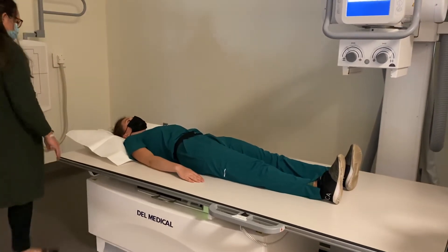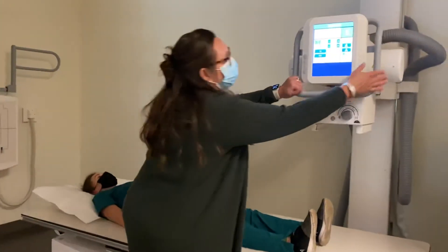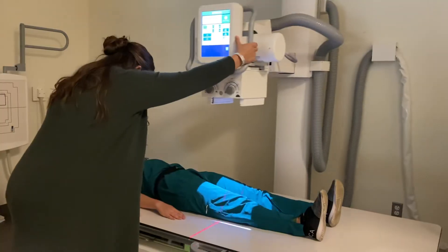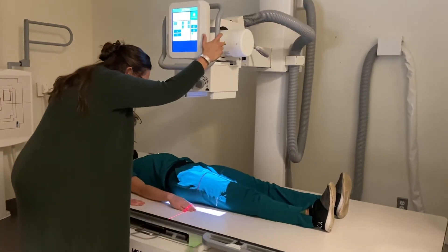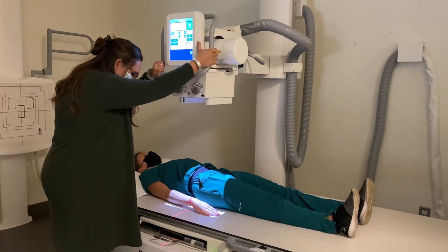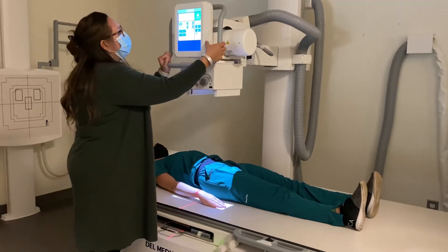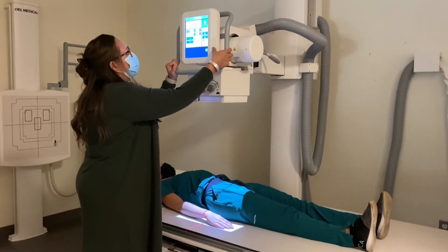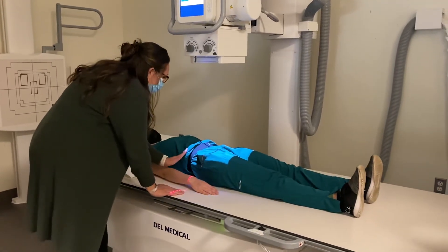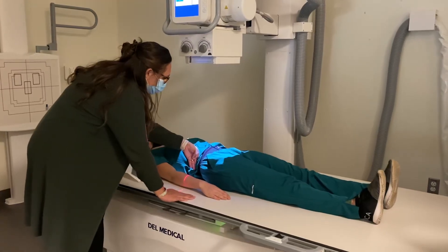I want to make sure that my patient is straight on the table. Then I'm going to line up my tube and bucky — I can move my table away so that I can see my bucky and ensure that they're lined up. I want to make sure I'm at the proper SID, so I'm going to raise that up to 40 inches. I'm going to find my patient's iliac crest, and this time we're going to center at the level of the iliac crest.